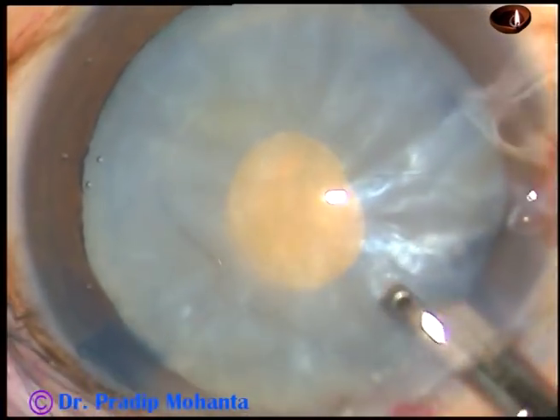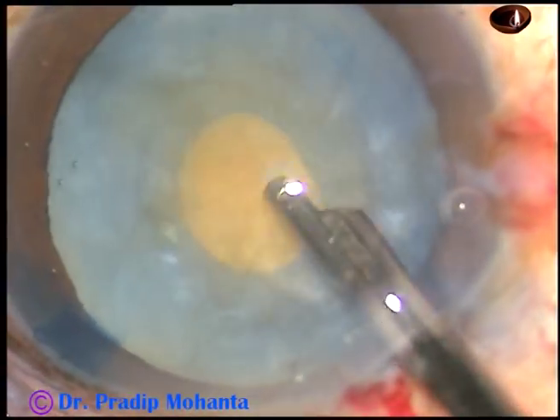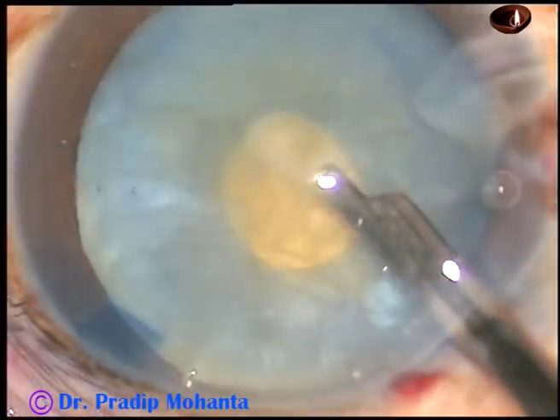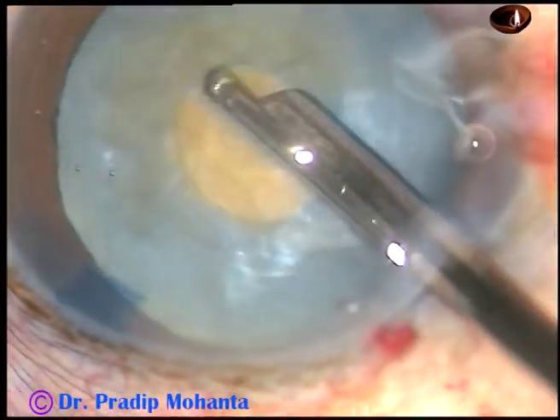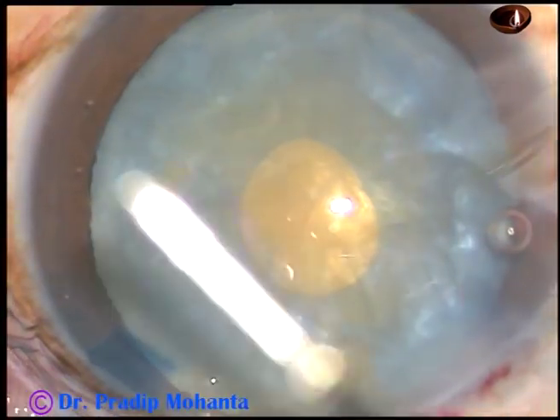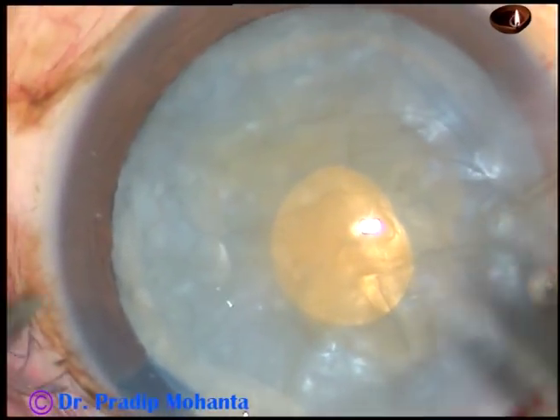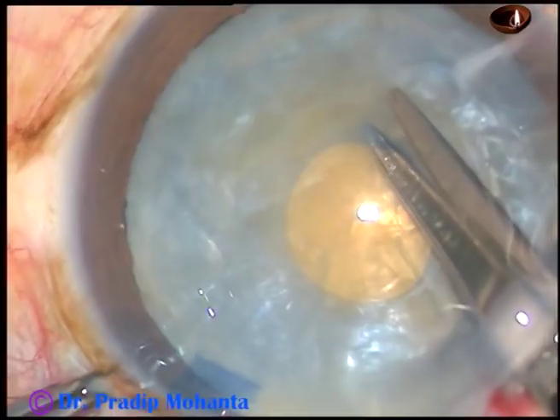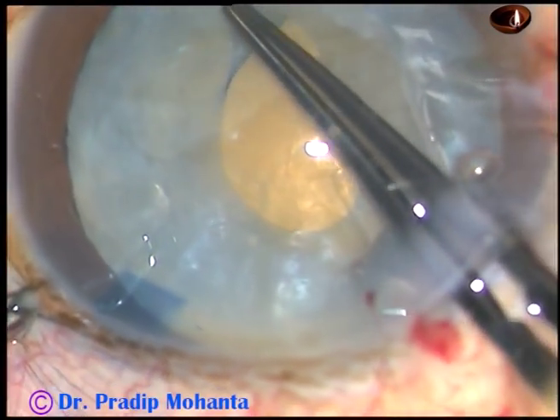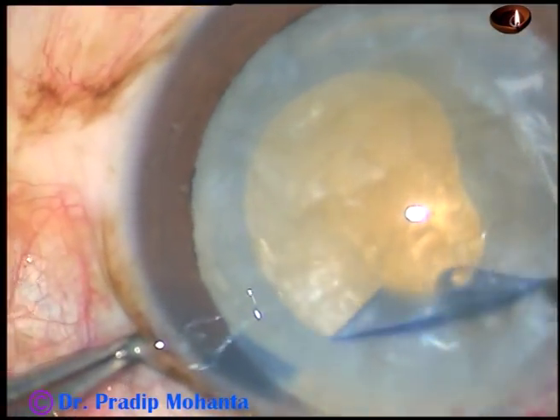Even if it tends to go to the periphery, there is enough room — you can bring it back and do a small rhexis at this point. Now use either bimanual IA or this very simple instrument, a 23-gauge Simcoe cannula, to aspirate some cortical lens matter. It will decrease the intralenticular pressure drastically and the cataract will behave totally differently. Now inject HPMC again. Take a Vannas scissor and make a small cut at the margin of the rhexis. It should be an oblique cut, not a radial cut.